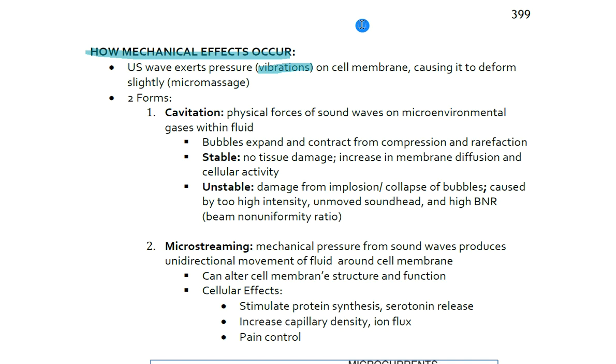The sound waves would travel through the water until they bounced off another dense object, another submarine, and come back to the original source. That way they could determine how far another object was. Of course it would bounce off fish or other things, but if it bounced off something dense and large like a submarine, they could identify the size, structure, and distance.